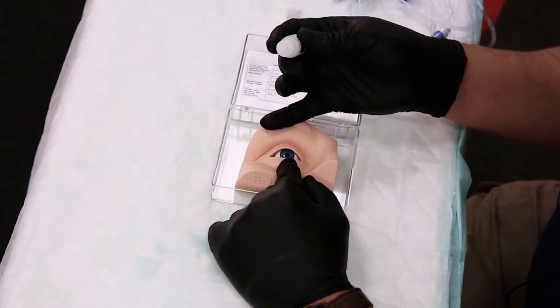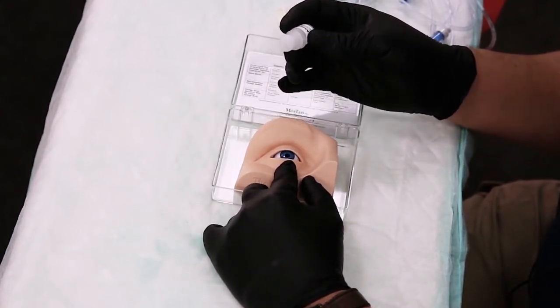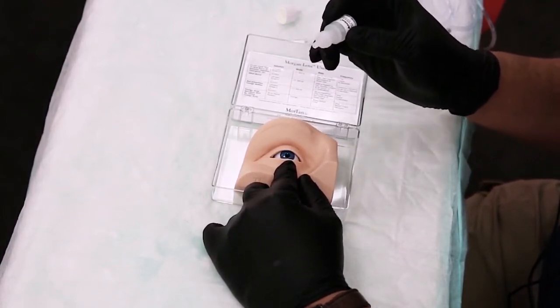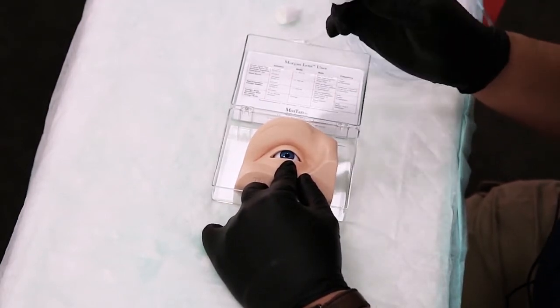Generally what we would do is to pull down the lower lid while having the patient look upward. You want to make sure that you warn the patient that this is going to sting for a few seconds, but after about 20 to 30 seconds that stinging sensation is going to go away and the eye will become numb.